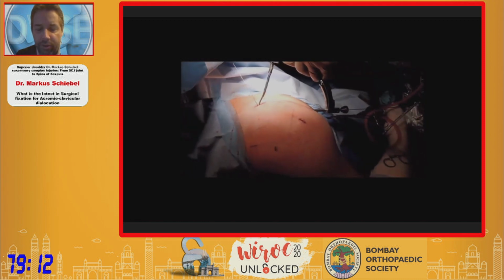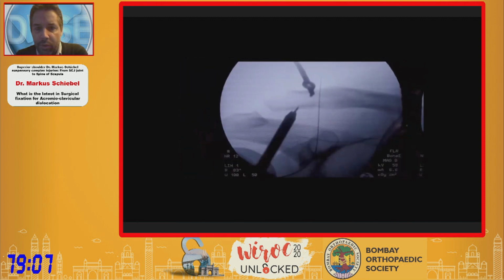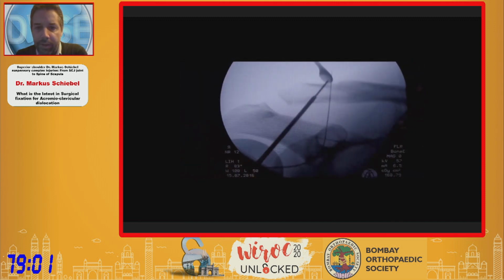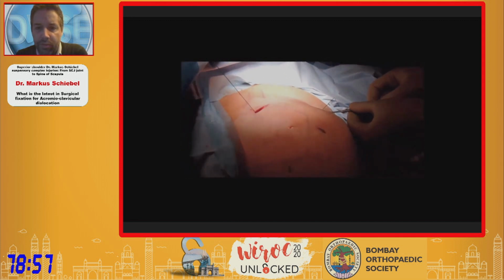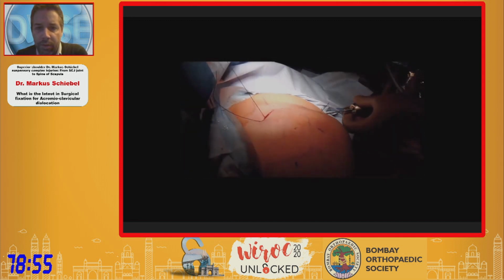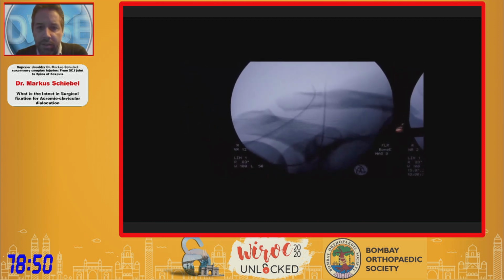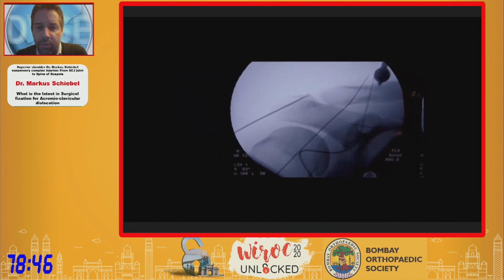So we switch our guiding device over the clavicle, and we come via the anterior-inferior portal percutaneously. We place a 1.25 millimeter K-wire, and this K-wire is over drilled with a 2.7 millimeter drill. We insert a nitinol wire, so now we have the AP drill for the AC cerclage in the clavicle, and we do the same now via the acromion.